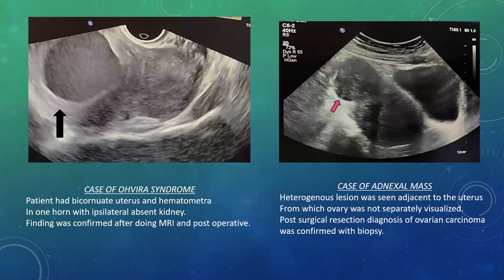Case 3: a case of obstructive hemivagina and ipsilateral renal agenesis, OHVIRA syndrome. Patient was diagnosed with bicornuate uterus and hematometra in one horn with ipsilateral absent kidney. The image shows a transvaginal axial section with hematometra on one horn and normal other horn of uterus. Finding was confirmed after doing MRI and postoperatively.